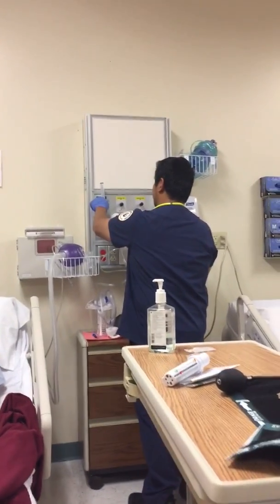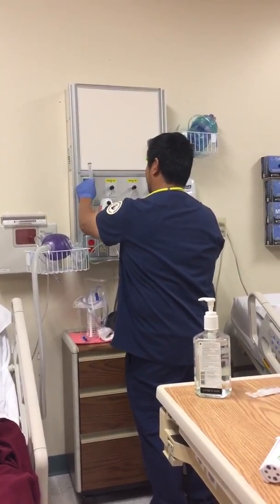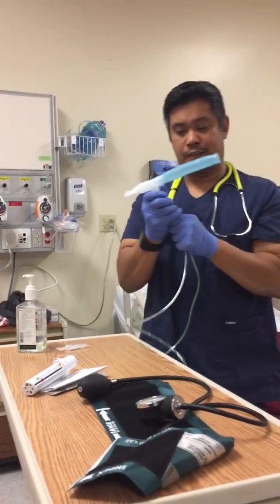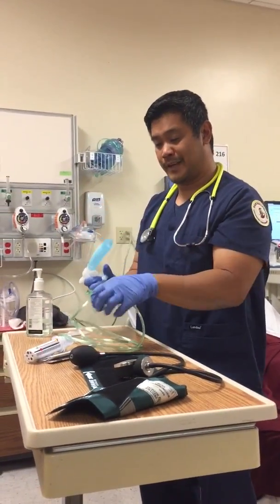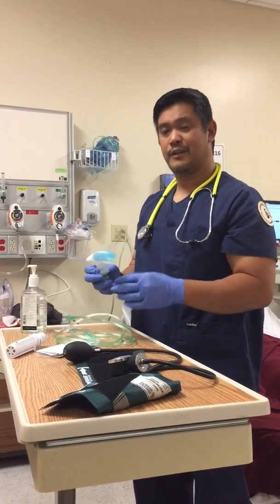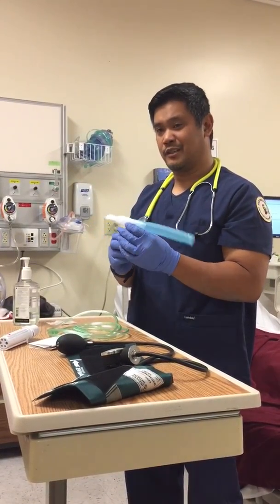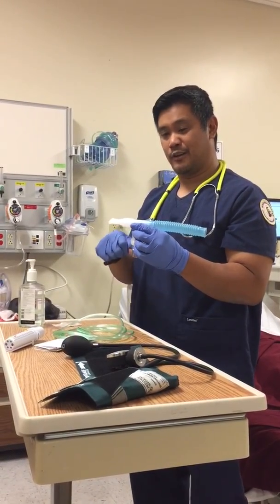So we normally set this to about 8 liters per minute. Turn it off. This would normally come in a sterilized bag, and this is for the patient. You would basically disassemble it and put it back in that bag, and leave it in the patient's room just in case other treatments are indicated down the line. We would essentially just rinse this and go ahead and air dry it or use the oxygen to dry it off.